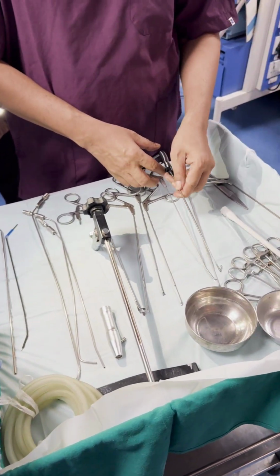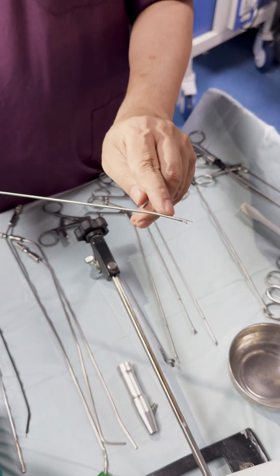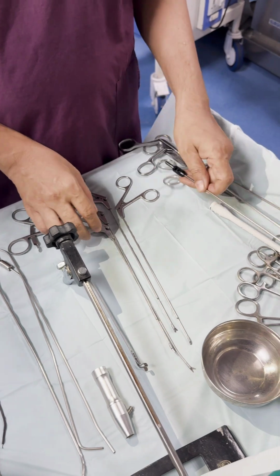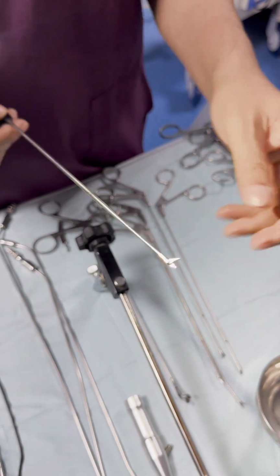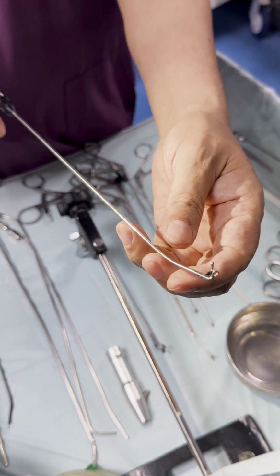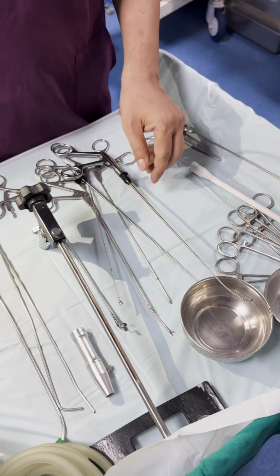Then there are tilted instruments like the scissor. We can see there is a 15 degree tilt anteriorly. Then there are malleable instruments available from stores. So this is a scissor which we can turn. This is a forceps which we can turn whatever the need is. So these are the instruments which can be helpful in operating on the anterior commissure.